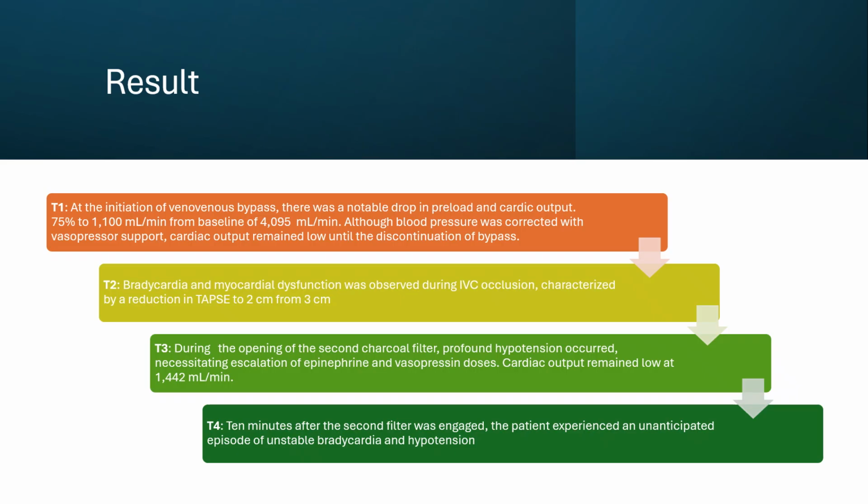At T2, we noticed another episode of hypotension. We also noticed on the echo there was bradycardia and myocardial dysfunction compared to the baseline that was observed during the IVC occlusion phase. And we saw a reduction in right ventricular function. The TAPSE went from 3 to 2 centimeters.